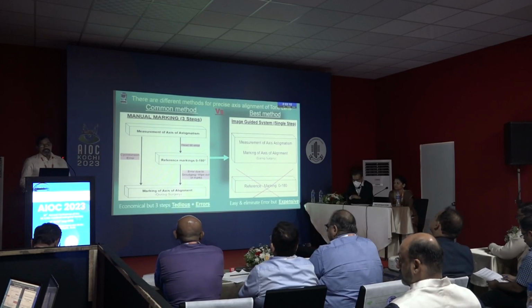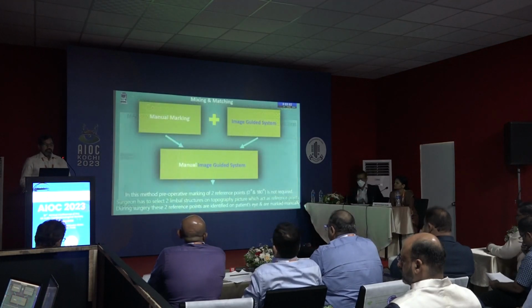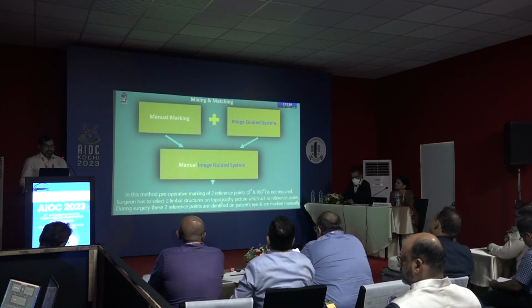So the best method presently available is the image guided system. It is a single step method, so it's easy and eliminates all the error, but it is very expensive. So by mixing and matching these two systems, we developed the manual image guided system.